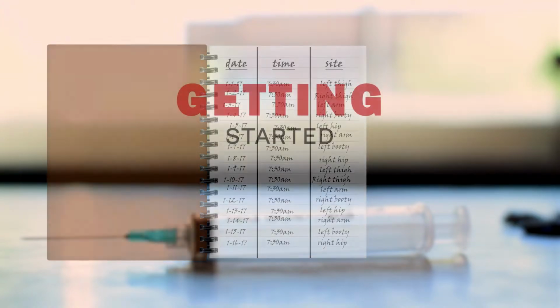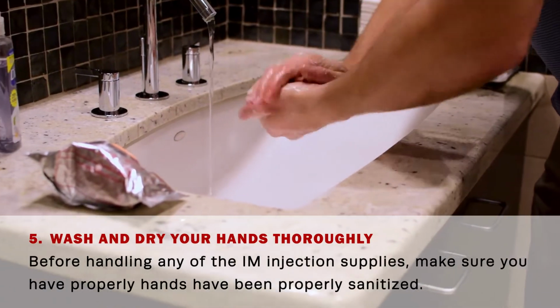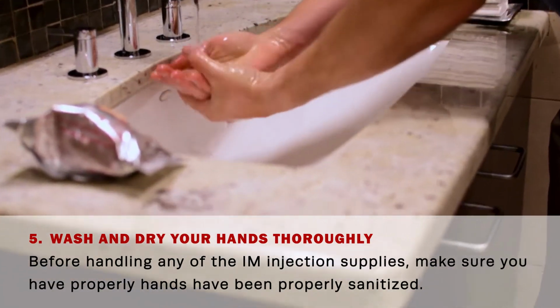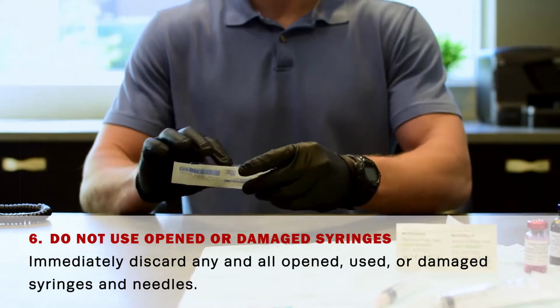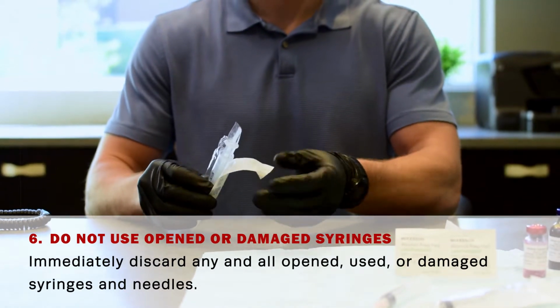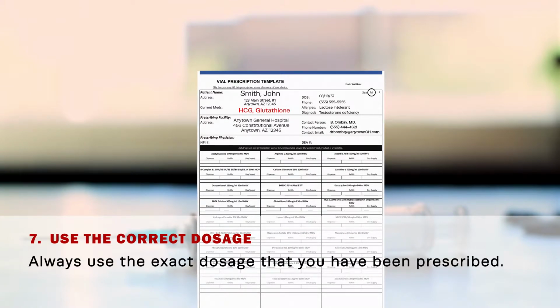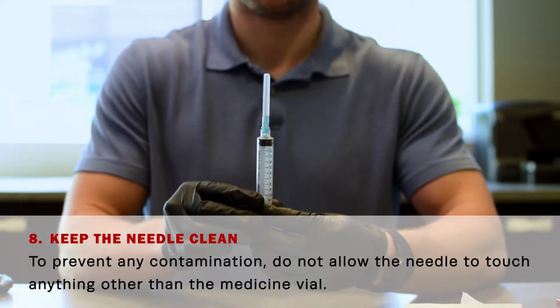It is now time to begin application of your IM injection medications. Wash and dry your hands thoroughly before handling the injection supplies. Don't use a syringe that's been previously opened, used, or damaged. Always use the exact dose that you have been prescribed. Don't allow the needle to touch anything other than the medication vial.